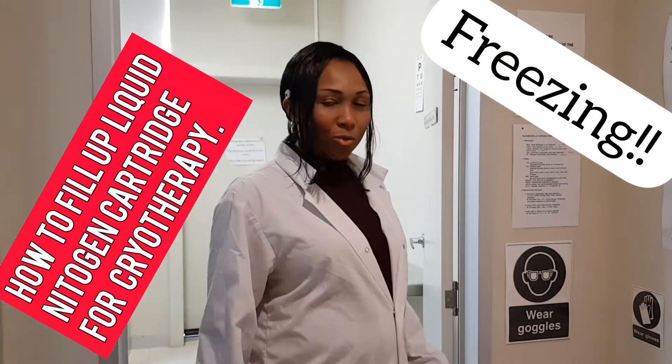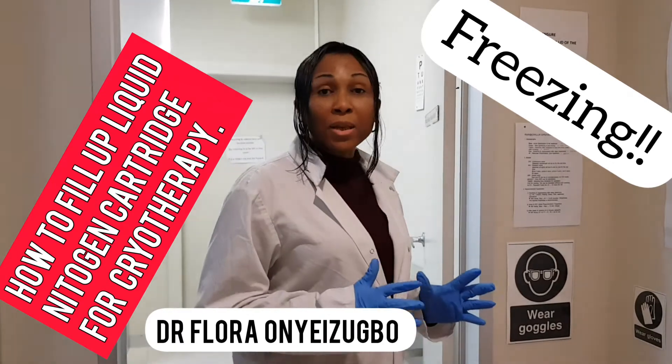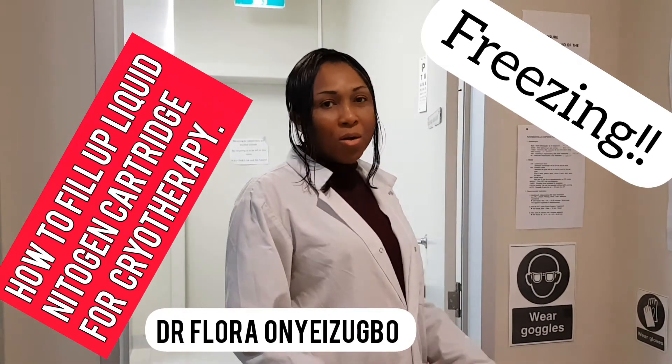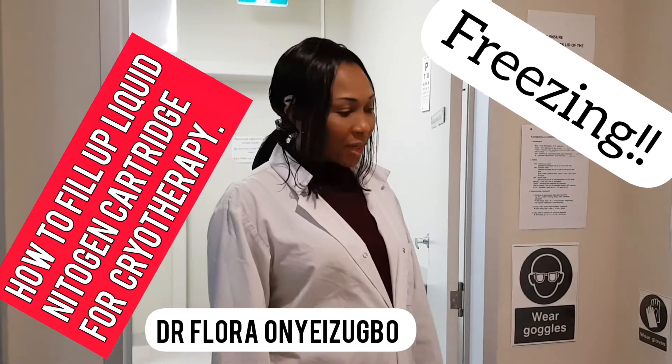Hello everyone, I'm Dr. Florian Isabel. Today I want to show you how to fill up liquid nitrogen, which is a pretty common technique in general practice and in dermatological practices.